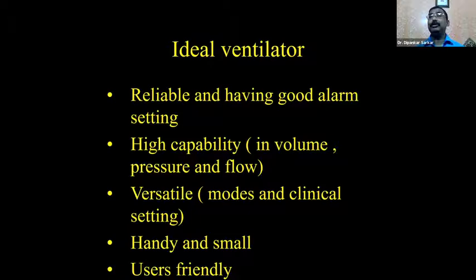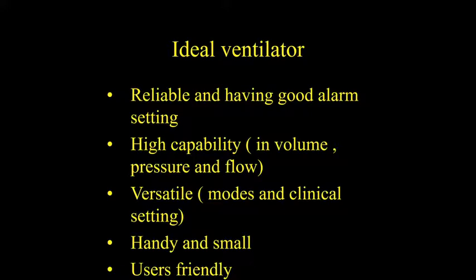Go there on the right side, then go to the left and up to down, and then you have it. No, it should be user friendly. You press a button and the job is done. That's how an ideal ventilator should work.